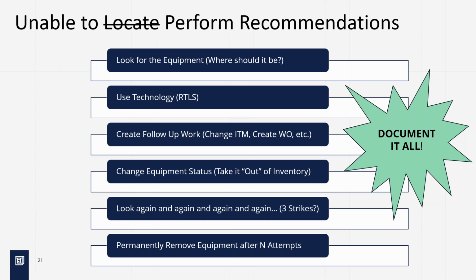Yeah. I think he's going to say there are some policies in hospitals that we have to send an email to the end user, maybe a leader, before you have a certain amount of days that you're looking for a piece of equipment, and then if you don't find it, it needs to be taken out of service. But before you do that, you have to send this email as a part of policy. Some policies have that. And that's usually a departmental ownership of inventory kind of report that you're sending out with the devices that are marked as unable to locate. I'm seeing some head nods.